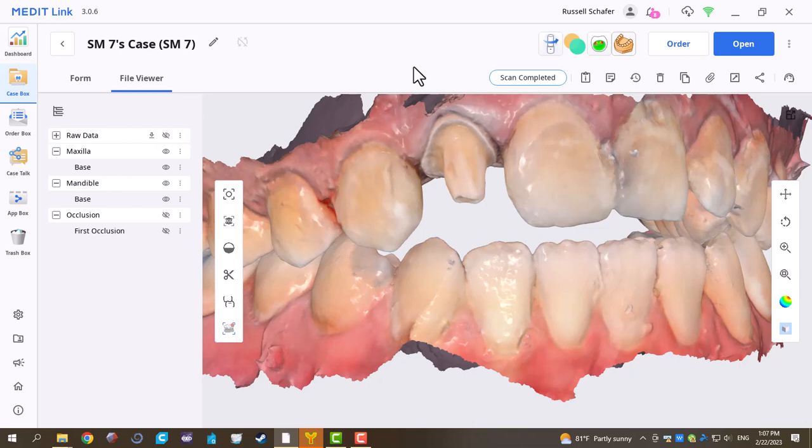I really kind of suck at making anterior temps, especially when there's not a guide to have here. And so what we decided to do for this young lady is print one out for her. She had caries on 6 and 8, so we fixed those teeth up right there. I got some other caries as well. You can see one on 8, and she has caries in other teeth, and we're going to fix those up as time goes on.